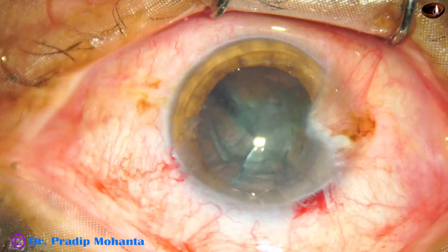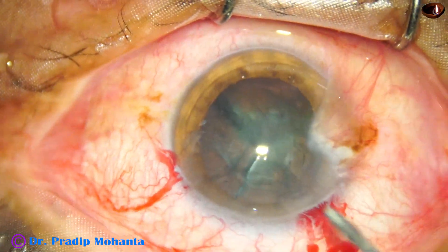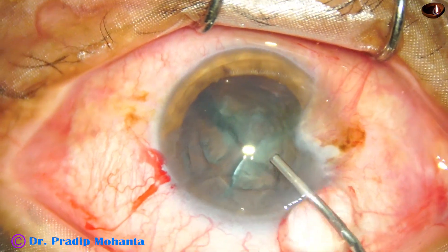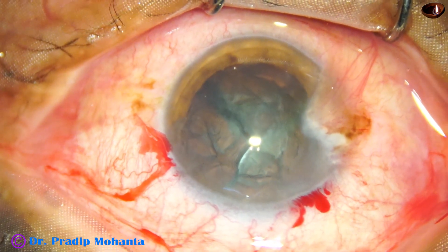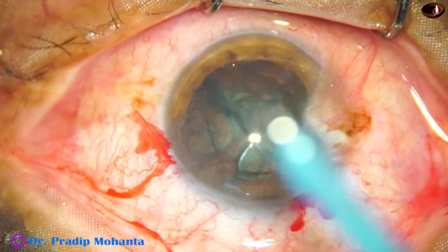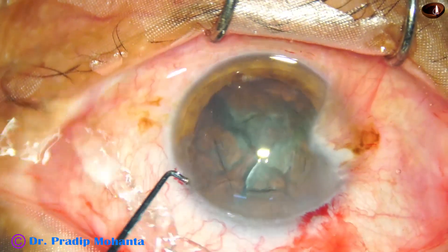So we have got three pieces — one hemi-nucleus has been divided into two pieces, and one more hemi-nucleus remaining. The other hemi-nucleus has been partially cut.